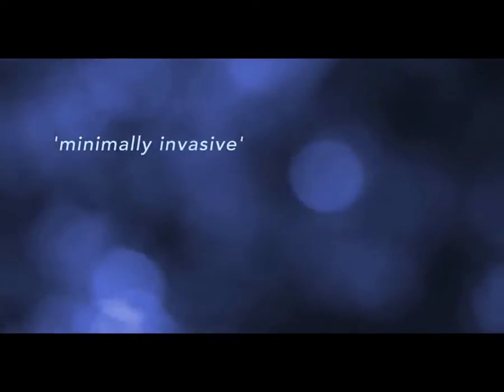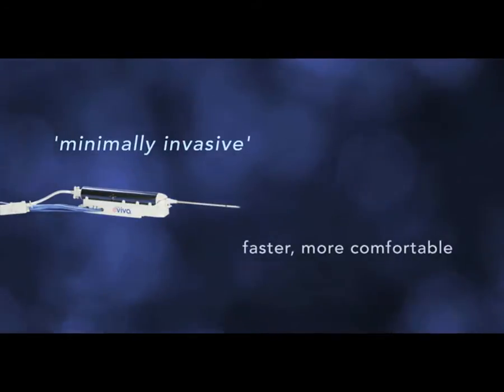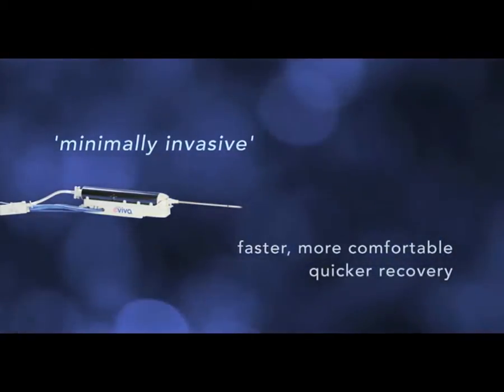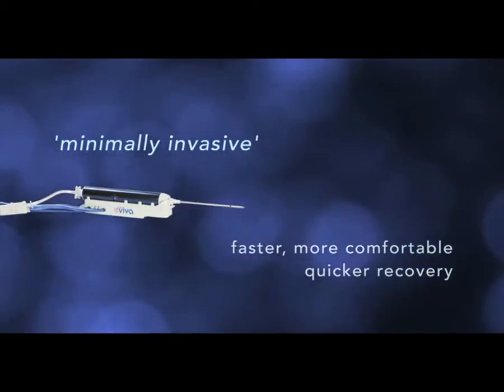Today, we have minimally invasive methods for sampling the tissue. That means we use a needle to take the sample with an imaging system for guidance. It's faster and more comfortable than open surgery, and your recovery time is much quicker.